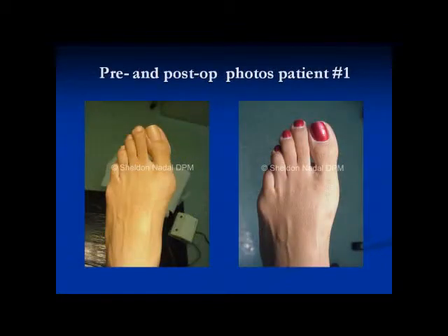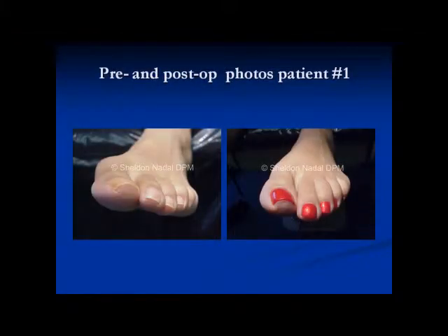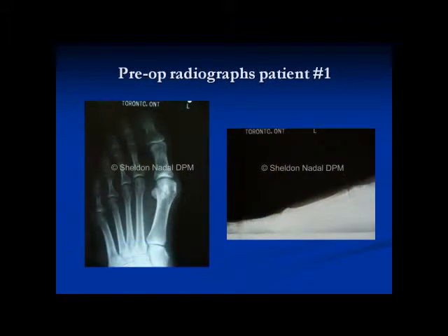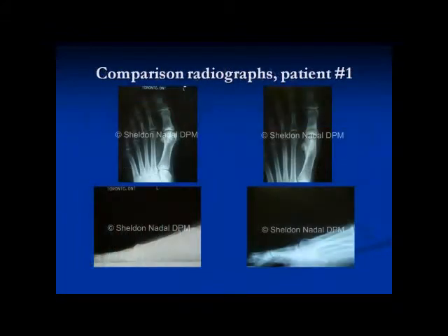And I've got some before and after. This is pre-op and post-op, and the key is to have nail polish on all your post-op patients because it looks better. One year post-op. And here's the pre-op x-ray. A Wilson osteotomy with K-wire fixation, Aiken osteotomy, maybe I did an adductor, I don't remember. It's important to look at the lateral, make sure the head is in the right position. This is 1 year post-op, and you can see the head is not elevated, and it looks pretty good.